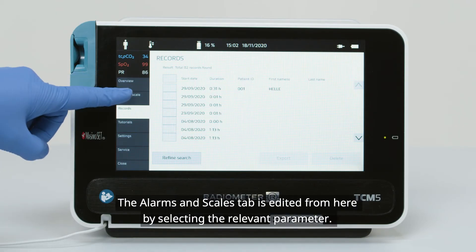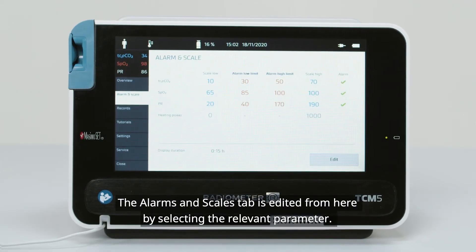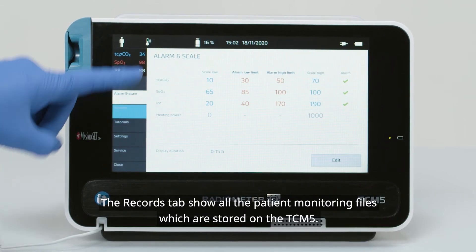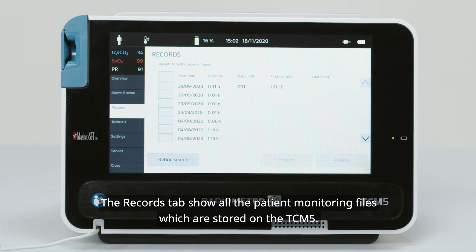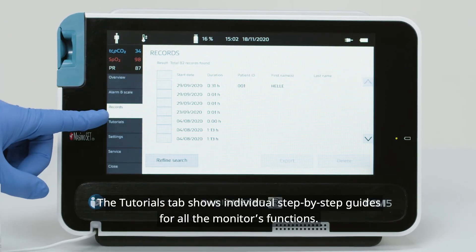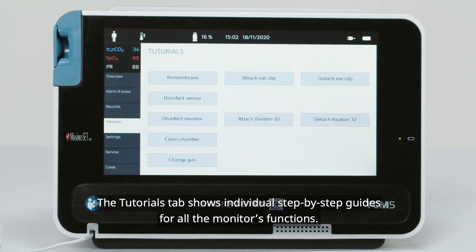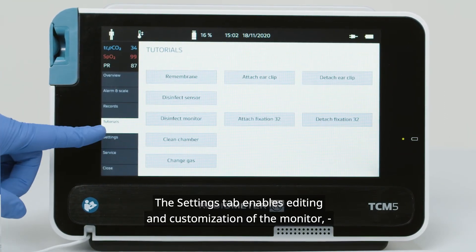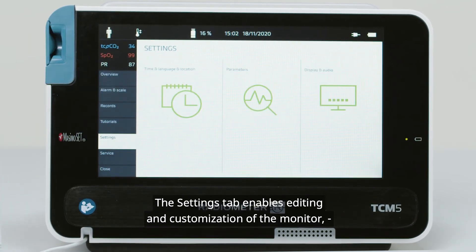The Alarms and Scales tab is edited from here by selecting the relevant parameter. The Records tab shows all the patient monitoring files which are stored on the TCM5. The Tutorials tab shows individual step-by-step guides for all the monitor's functions.